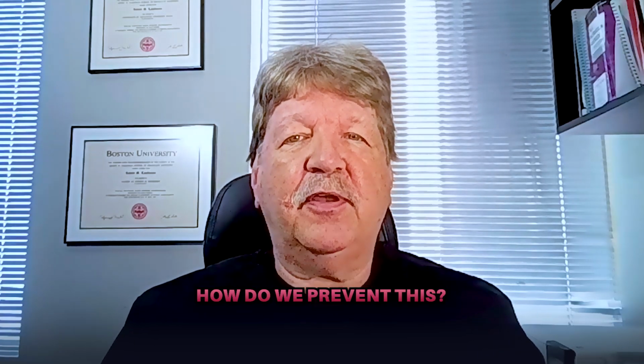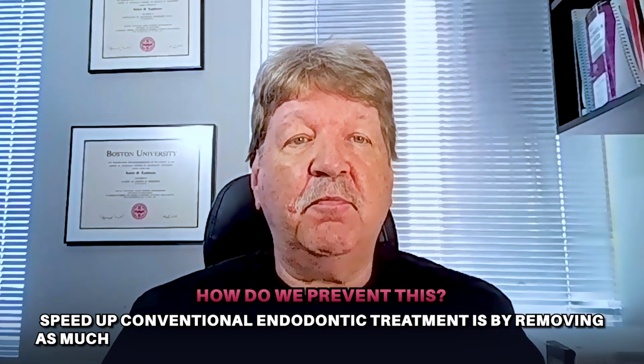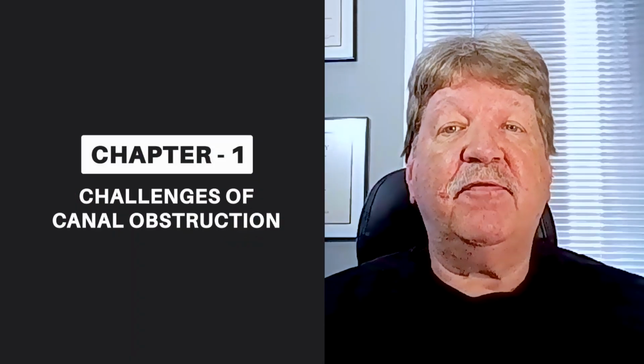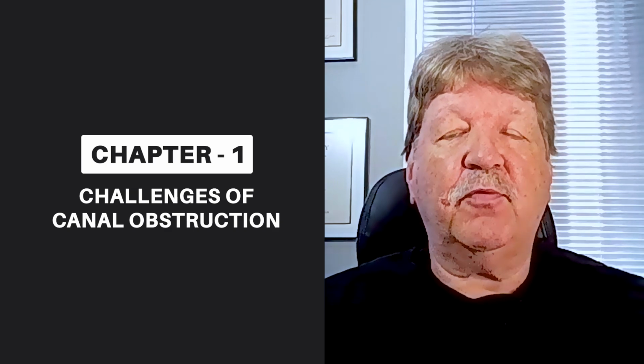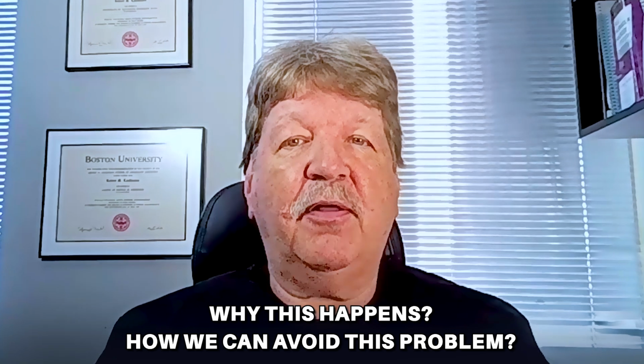One of the best ways that you can speed up conventional endodontic treatment is by removing as much of the pulp as possible prior to instrumentation of the canals. Leaving vital pulp in canals creates unnecessary obstruction and can result in canal blockage or inability to reach the working length. Let's examine why this happens and how we can avoid this problem.